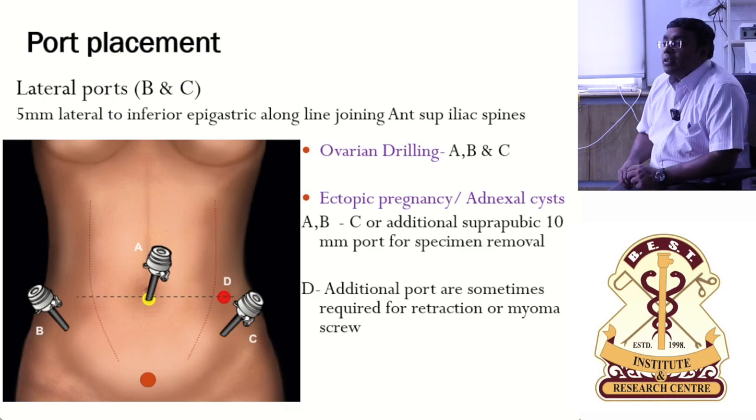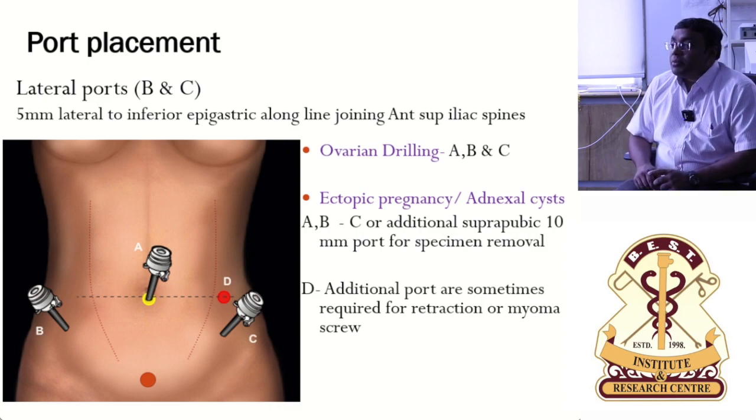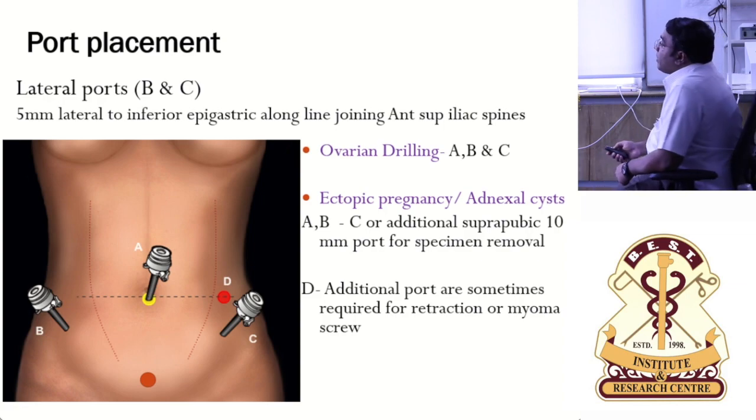What is azimuth angle? Yes. I want you to read and tell me tomorrow. What is azimuth angle? There are 3 angles in laparoscopic procedure during port placement and instrument handling. You will have to find out all the 3 and tell me. Okay.